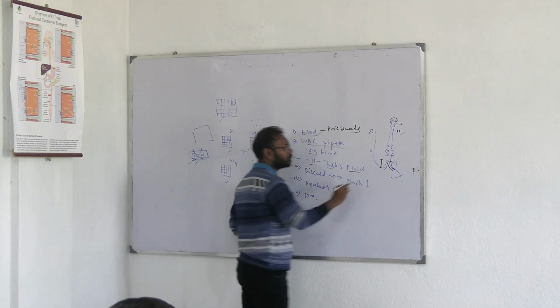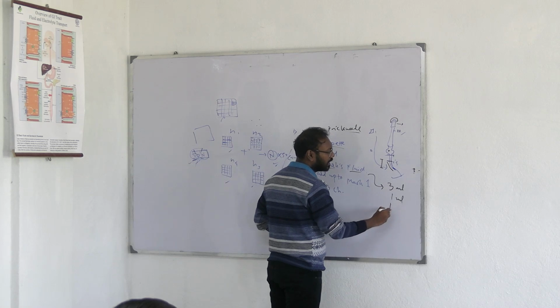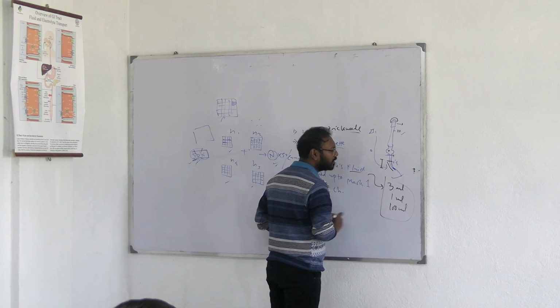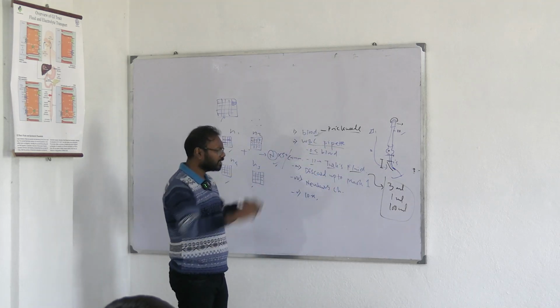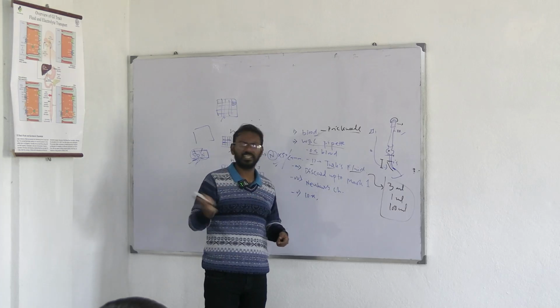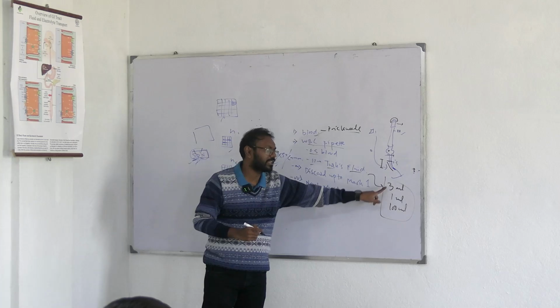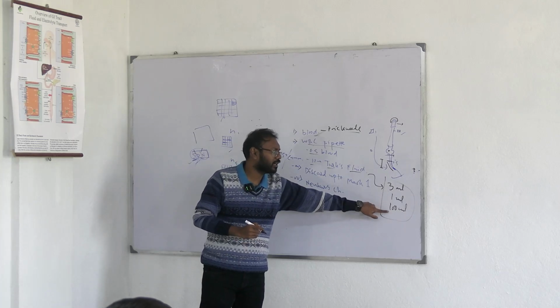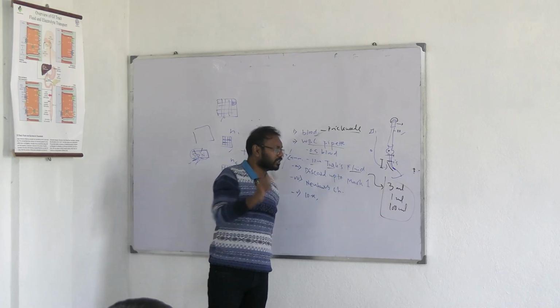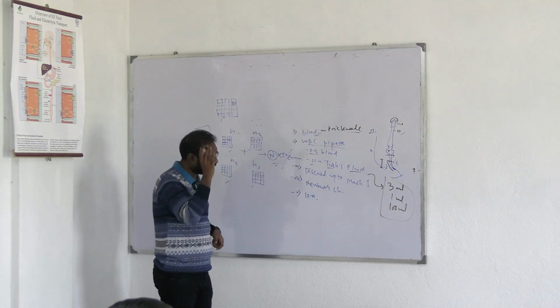How many ml are there? 3 ml of glacial acetic acid, 1 ml of Gentian Violet, and 100 ml of distilled water. The total is 104 ml in an ideal solution. We mix it this way, then we sell it industrially in 100 ml, 500 ml, and small 50 ml tubes, but the composition percentage is like that. In every 100 ml distilled water you have 1 ml of Gentian Violet and 3 ml of glacial acetic acid. Ask about this, they will ask you in the exam.